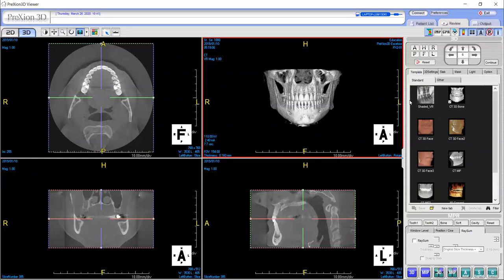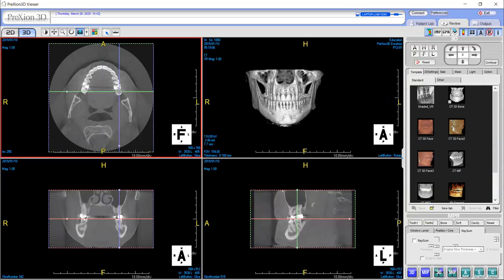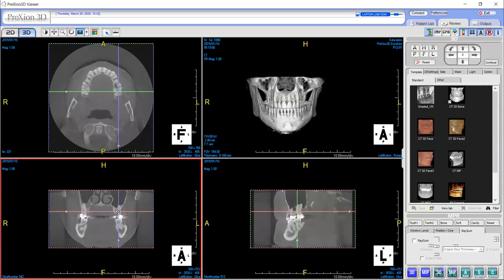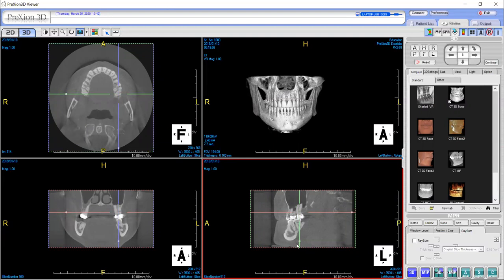I'm going to start off on your upper left view, which is the axial plane. I'm going to hover over the center of the crossbars until I see the white caliber, and once I see that I'm just going to pick up those crossbars and drag them over to a specific site. You can do that in any of your planes — simply hover over the center of the crossbars until you see the white caliber and drag them to the specific site.